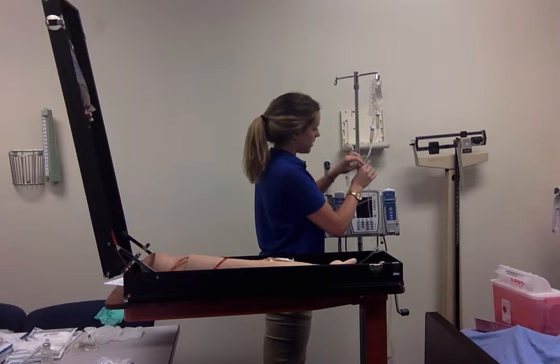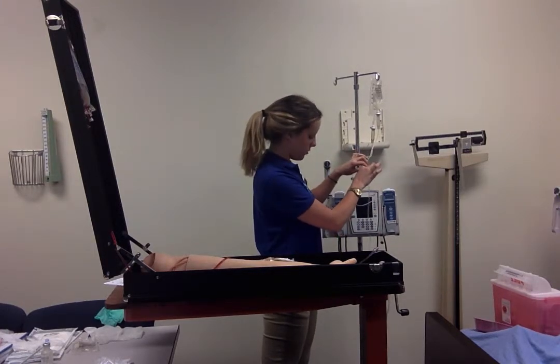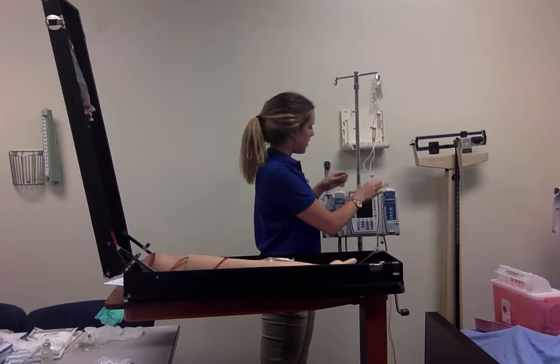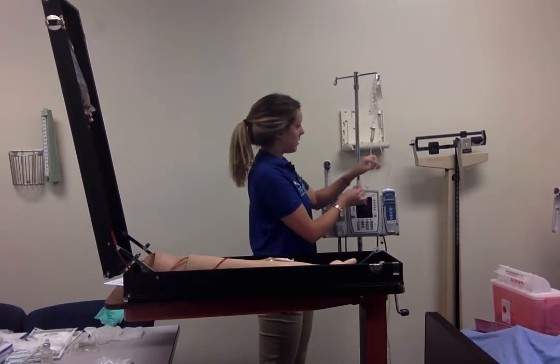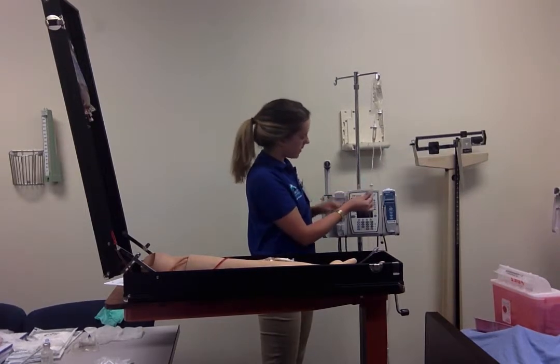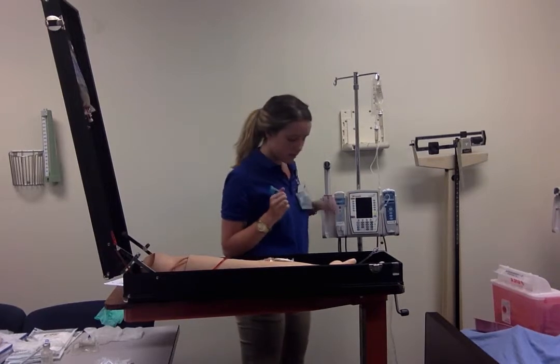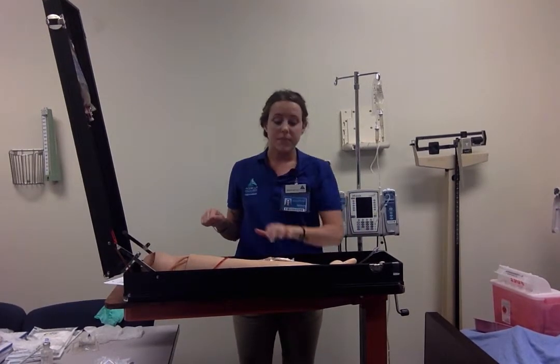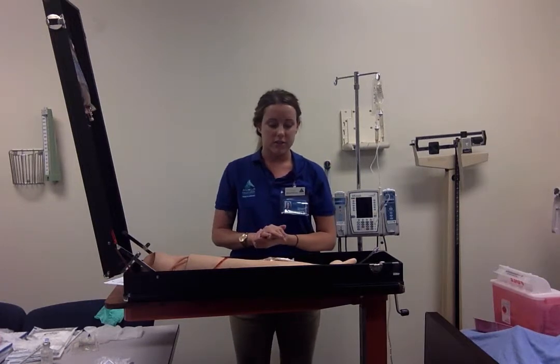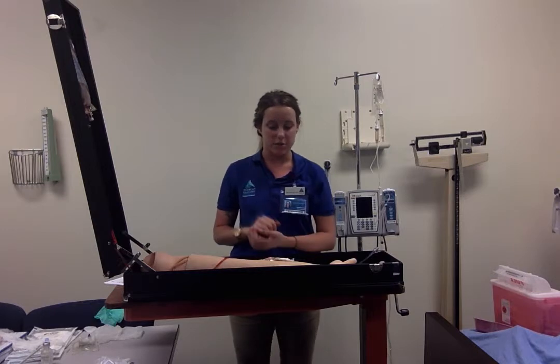This is hooked, and since this port is above the primary clamp, I do not need to clamp it. I will, however, need to unclamp the piggyback, so I'll unclamp that, and I'll go ahead and set this at 17 drops per minute. And I'm going to assess again the site and make sure everything looks good, that the patient's not having any reaction or inflammation or redness.